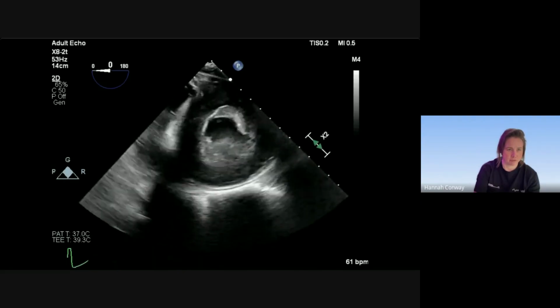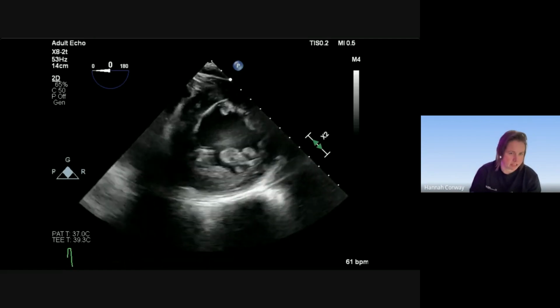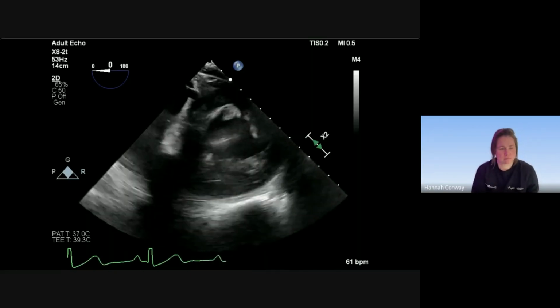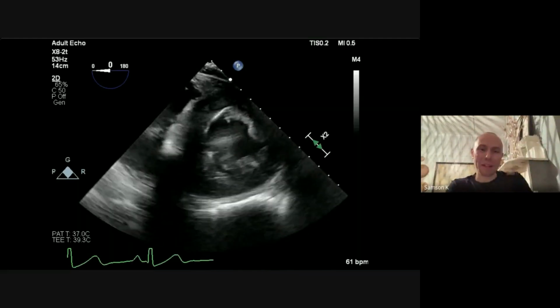And then finally, going into the belly, we've been able to now get a good look at our heart. Any commentary on the ventricular size and function? We are a shy group. The LV function looks pretty good from this view, hyperdynamic even.